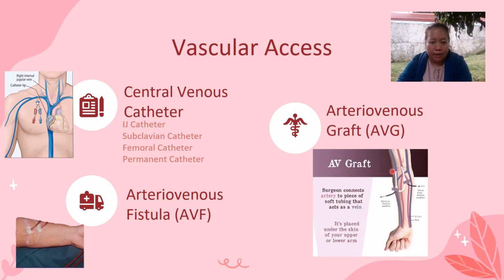So in the arteriovenous fistula, you are using a vein here, while in the arteriovenous graft, you need a synthetic tube instead of the artery or the vein, because most of the time, the patient's veins are weak and small. So same with the AVF, there are two cannulas inserted during dialysis, yet they will be inserted into the synthetic tube instead.